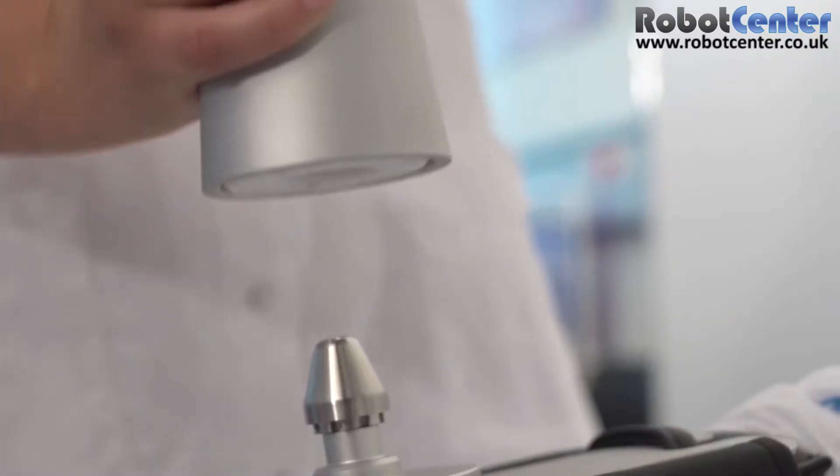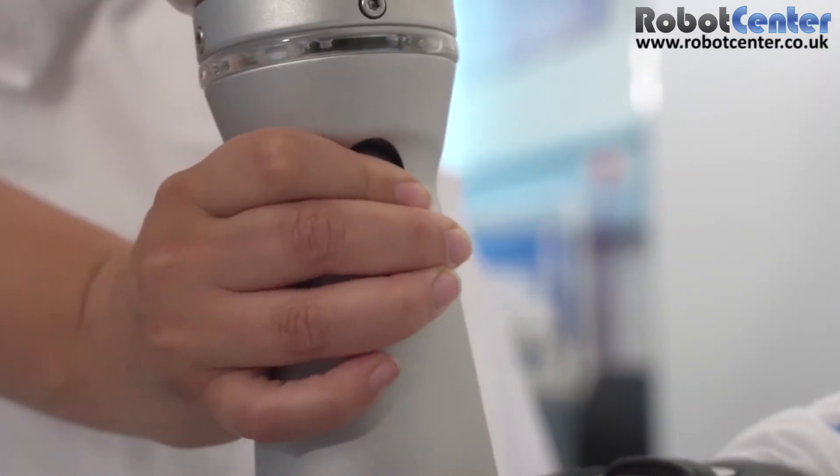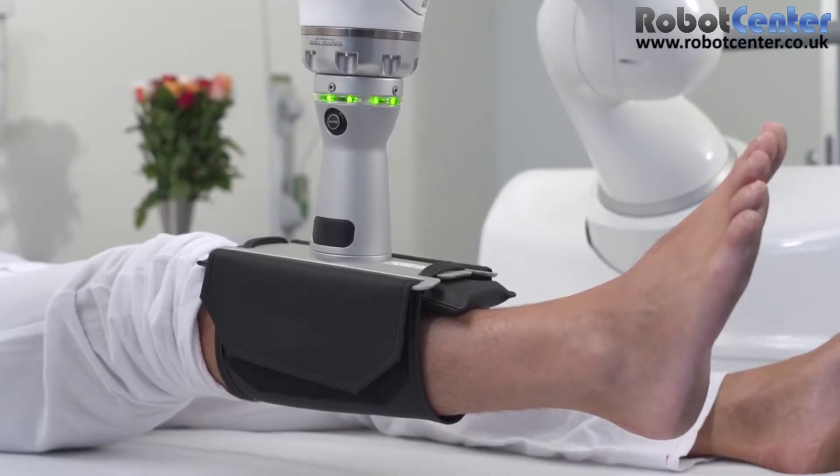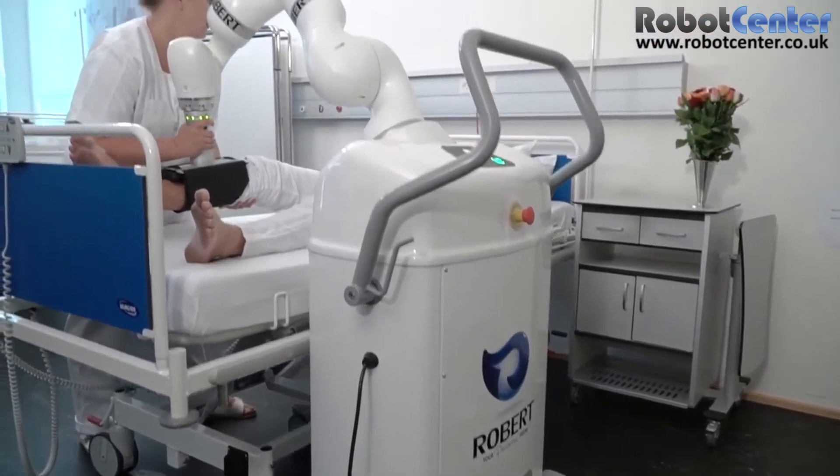The two parts are easily linked up by pressing the robot arm's coupling link onto the brace. The therapist will then push record before performing an individual exercise that is particularly beneficial for this patient.